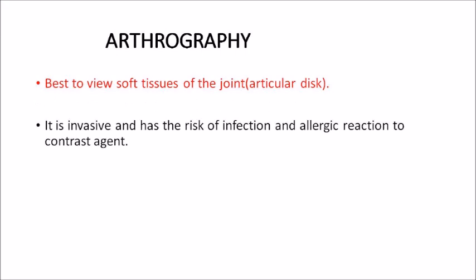Next we have arthrography. It is performed by injection of a radioopaque contrast agent and is radiographically assessed. It is best to view the soft tissues of the TMJ joint, including the articular disc.